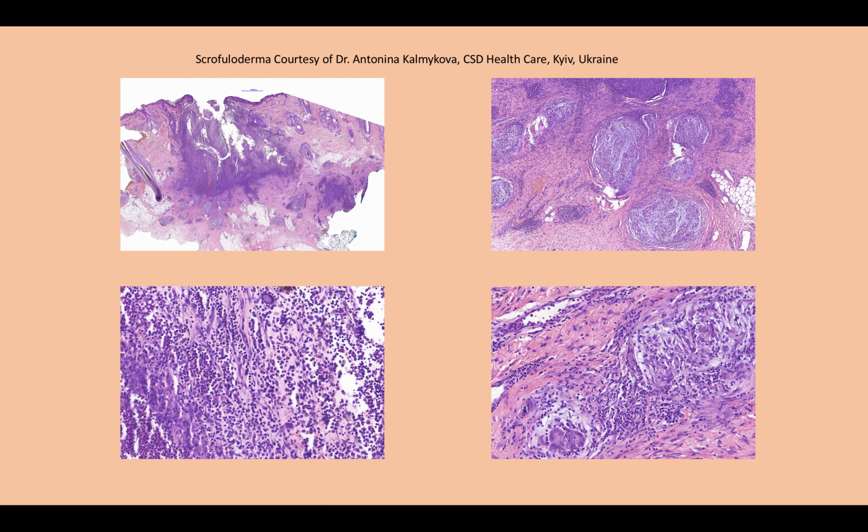observation. Now, scrofuloderma is a form of tuberculosis in which an underlying lymph node or matted lymph nodes or perhaps joint infection points up to the surface, and so you get these very deep ulcers lined by granulomatous inflammation and some suppuration.